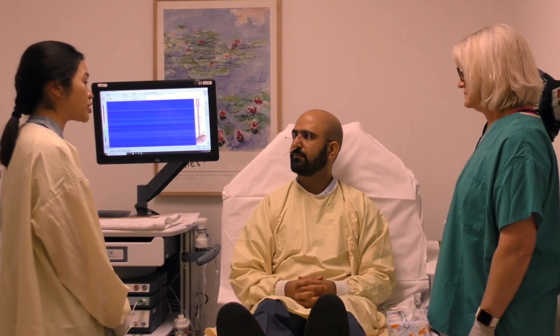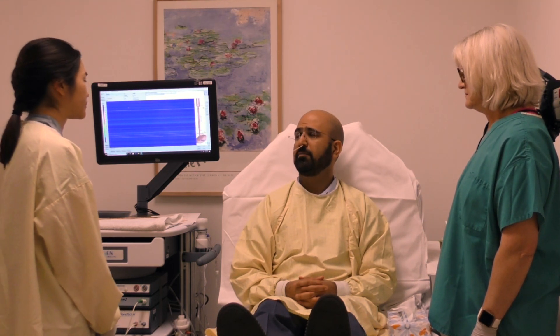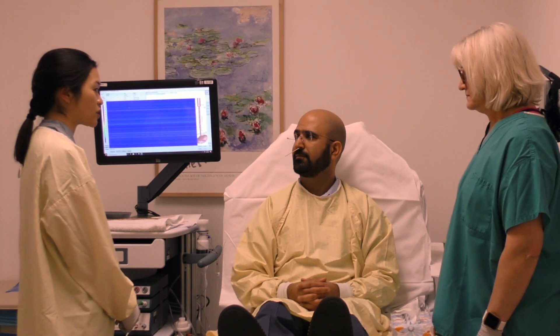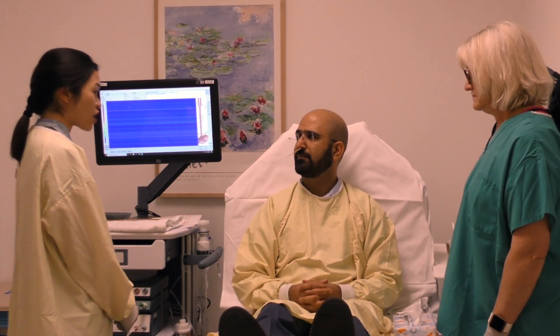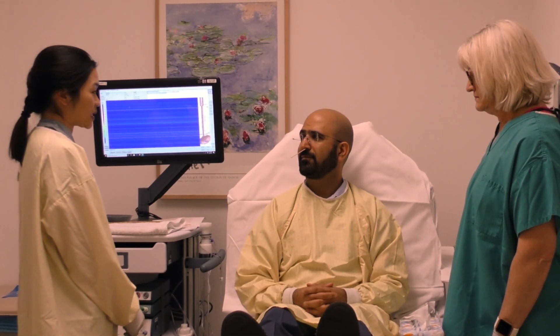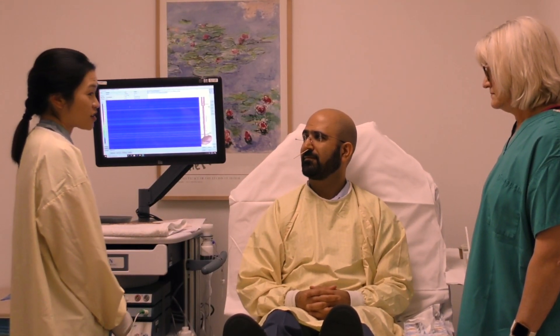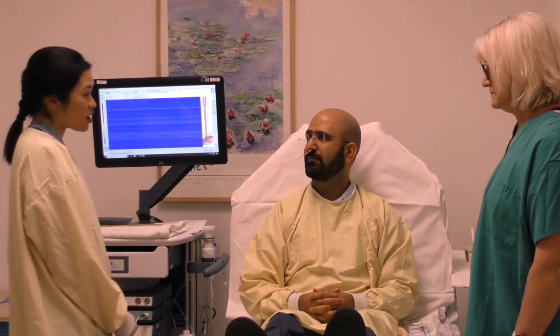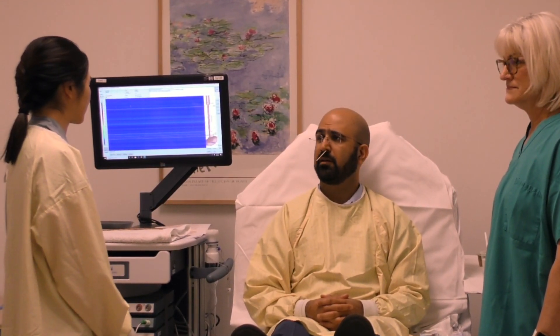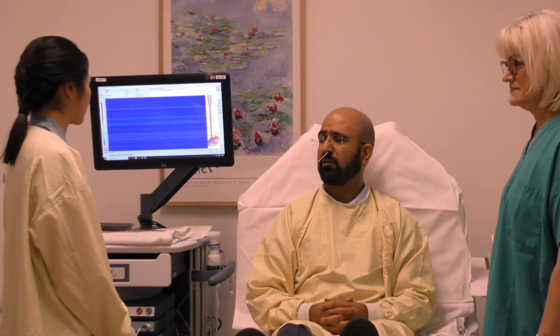Dr. Kishishot: I'll be doing your esophageal manometry today. How are you? Okay, a bit anxious. Being anxious is normal, especially when you're doing something new. We will tell you what to do and talk you through this. The procedure, for most people, takes about five minutes — waiting is the hardest part. Dr. Goodman sent you here because of trouble swallowing — is that right? Yes. For the last three years I've had trouble swallowing, mostly with meat but sometimes with pills.